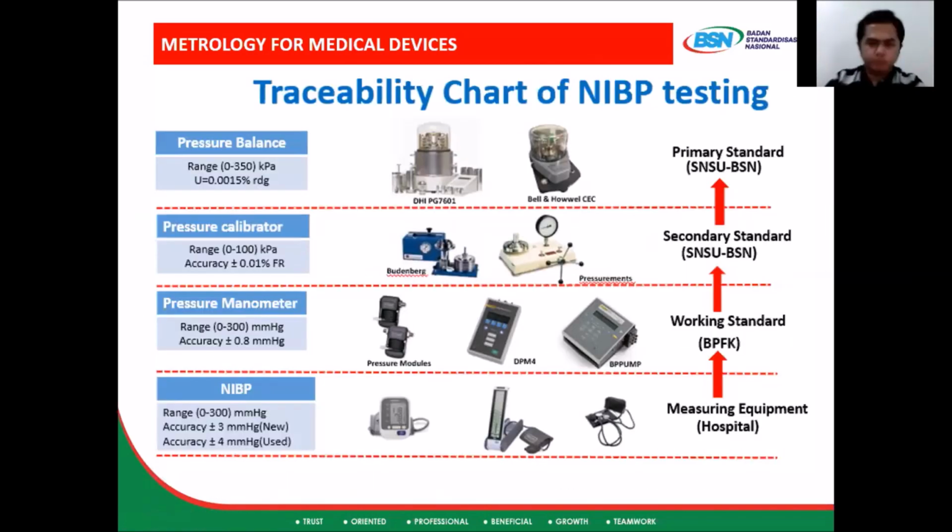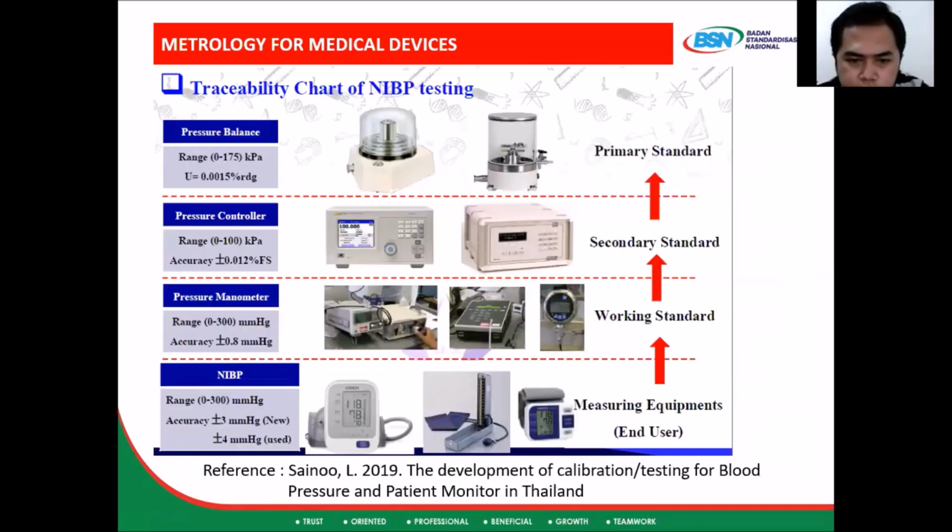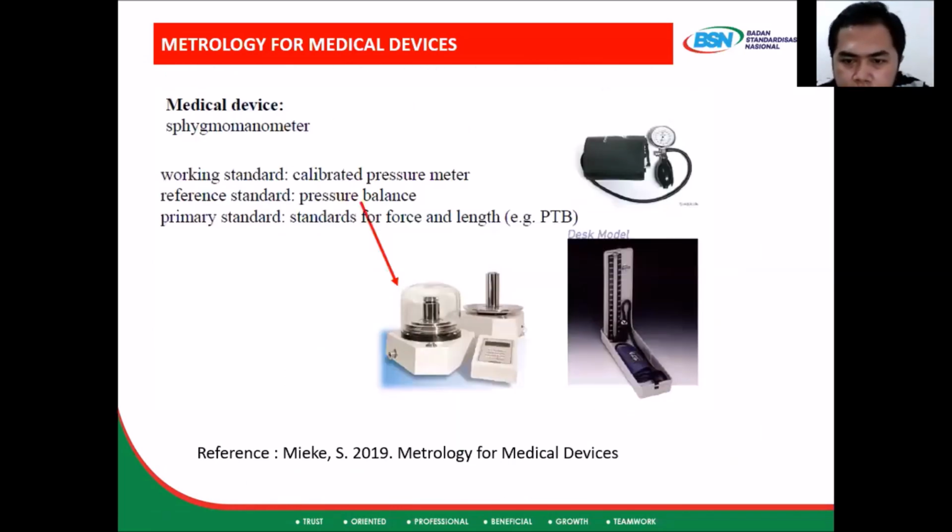Well, I will explain about the difficulties to calibrate the automated NIBP device. So as we know, to calibrate the manual NIBP device, the method is simple.